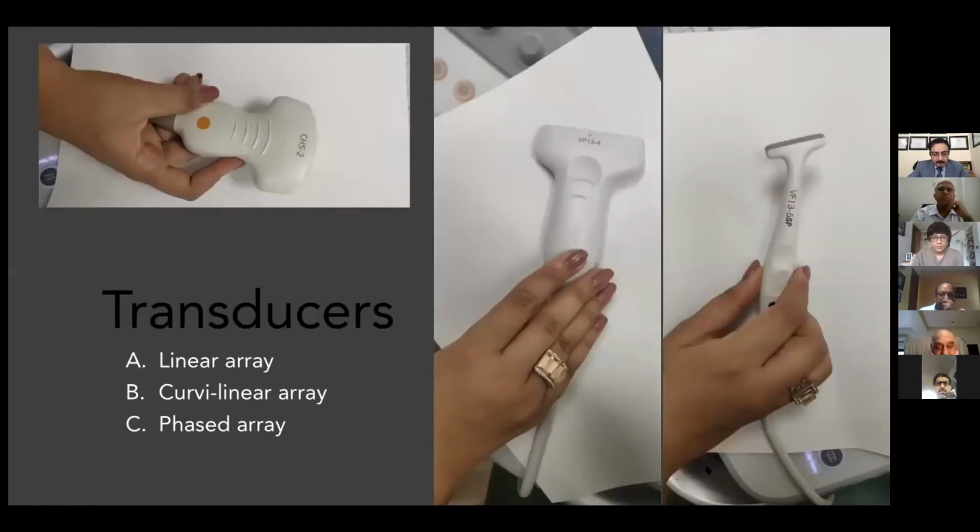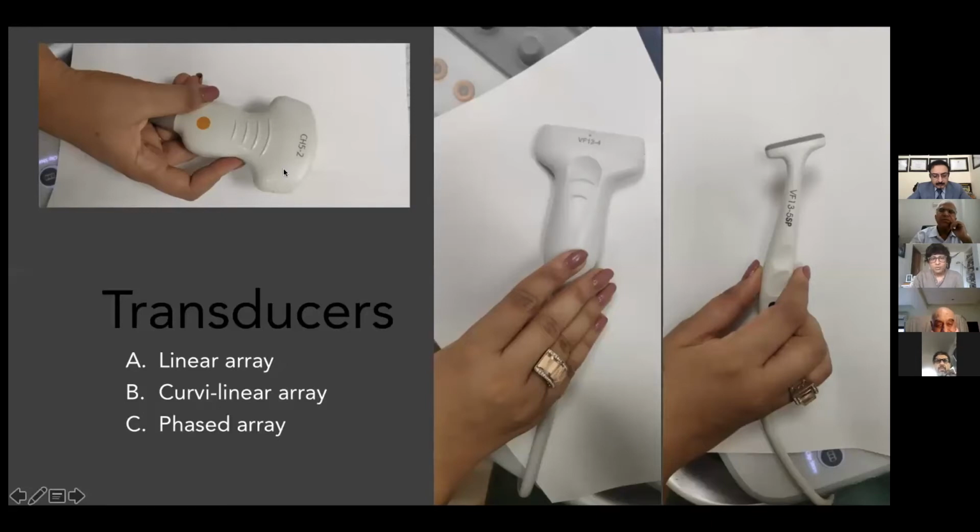These are usually the probes that we use. This is a curvilinear array probe, which is about 5 megahertz. This is the linear array probe, which is about 12 megahertz. I don't have an image of the phased array probe, but this is the other one that I particularly like for the neck and for the upper limb, which is the hockey stick probe. In our case, this is a 13 megahertz probe meant for superficial structures.